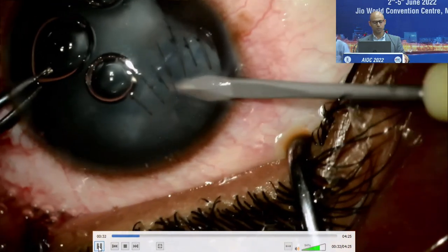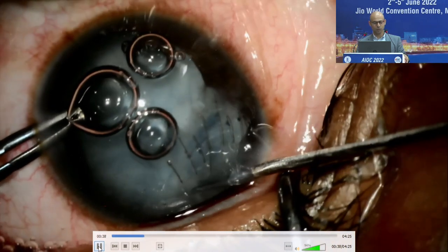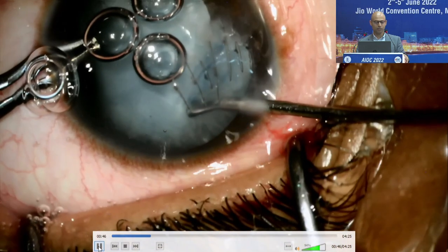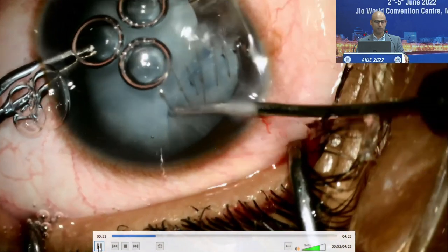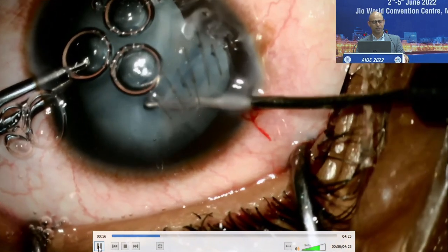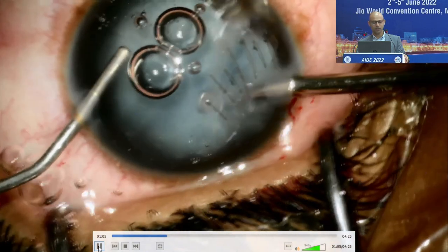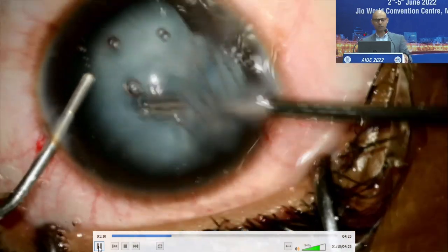So I stained with trypan blue, and there was an anterior capsular tear. The configuration was not very clear, so I tried to make a nick on that tear and try to manipulate some kind of a rhexis from it, but it was just not happening, and it essentially extended peripherally. So I decided that instead of causing more damage to the anterior capsule, at this stage I would start using a vitrector straight away and enlarge the capsule with that only, and then eat away whatever cortex or vitreous matter there may be in that area.